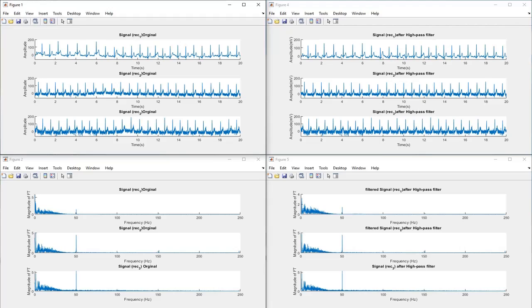Type 2 filters have ripples in the stop band instead of the pass band, which makes it a smoother response in the pass band. A high pass filter had to be made to filter out the lower frequency noises. According to the study we did, theoretically an ECG signal should not have any frequency lower than 0.67 Hz. Therefore, we made a fourth order high pass Chebyshev Type 2 filter, also called inverse Chebyshev. Chebyshev Type 2 has a lot of wanted features, like a steeper roll-off than the Butterworth filter.